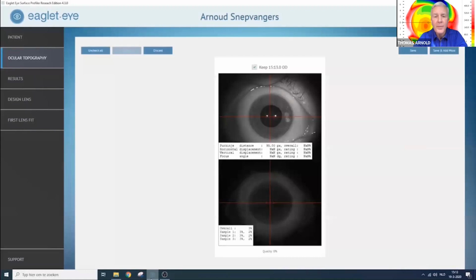that we desire. And the important thing to identify a good image is obviously we want the lids well retracted so we see a good amount of the surface sclera. You want the Purkinje images pretty much aligned with the little red reticule in the middle of the cross. And then I'll point out to you, on the right side of the image, you'll see two little gray blobs, like two little clouds there. And those are alignment images. So they should be above and below the horizontal red line and fairly aligned vertically.